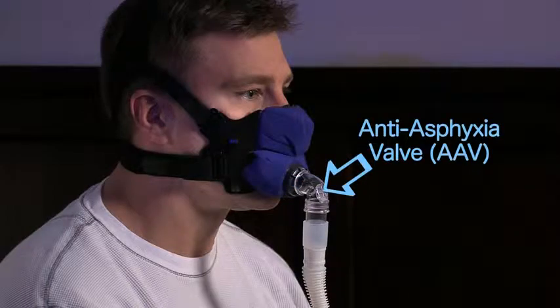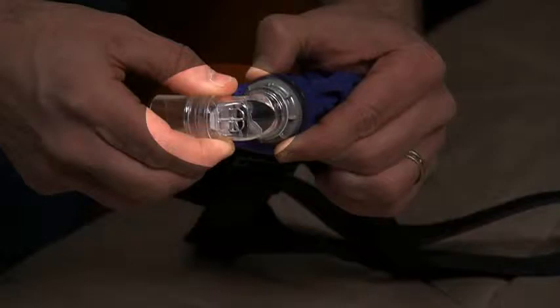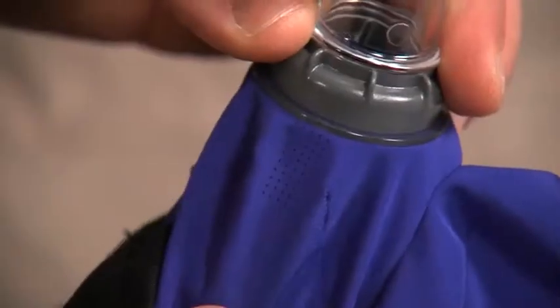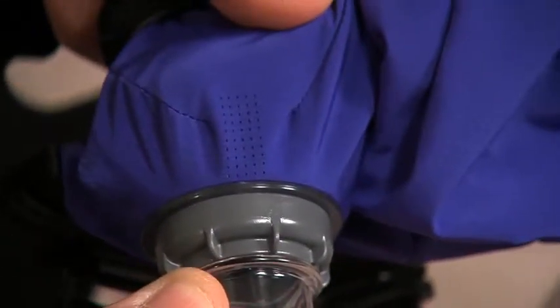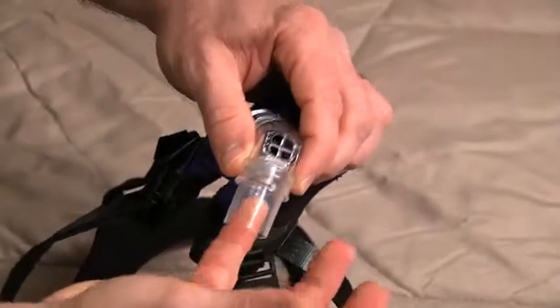The 90-degree elbow anti-asphyxia valve (AAV) is located on the oral interface of the mask and should never cover the nose. The oral interface also includes two sets of exhalation holes on either side of the 90-degree elbow, and the mask size is printed on the bottom.